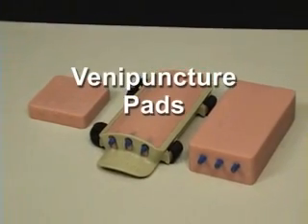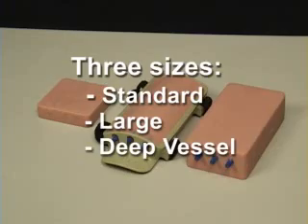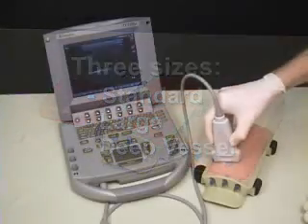Simulab's venipuncture pads are the industry's most realistic and affordable pads, and they're available in three different sizes to meet your educational needs.